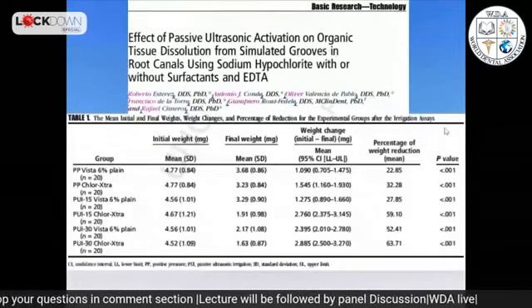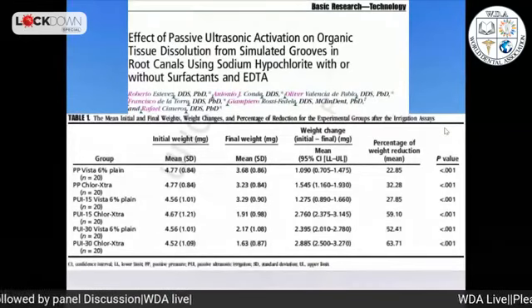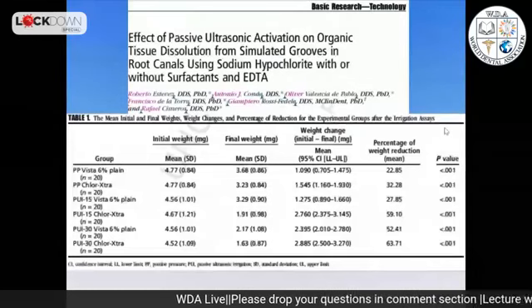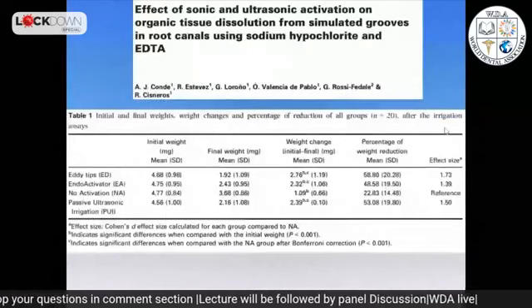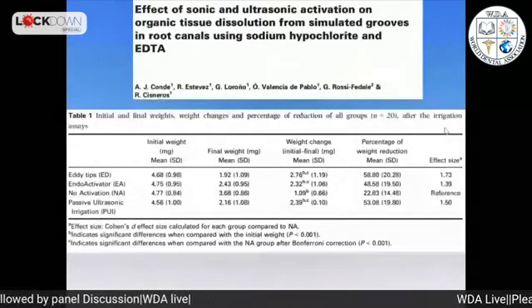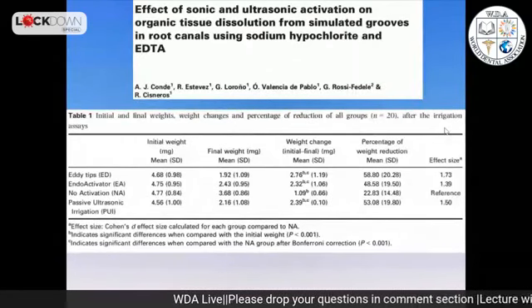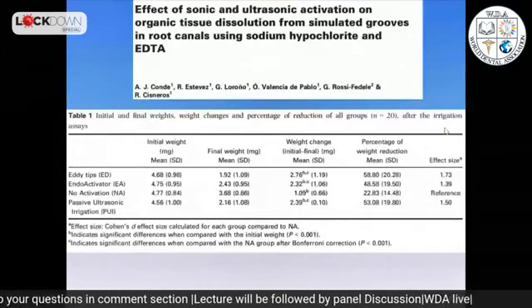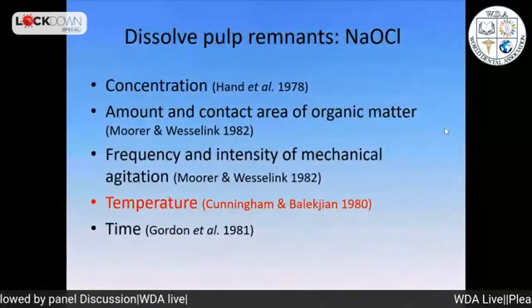And we noticed that there's a twofold factor, two things that work together. So it's not only agitation or surfactant, it's what is added to the chemical that makes the difference. Here is a similar study where we compare different agitation techniques with the same hypochlorite, and we find that really the important thing with this chemical is just to agitate. That's the important message.